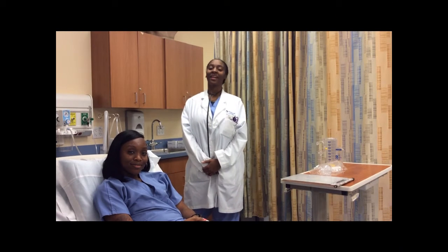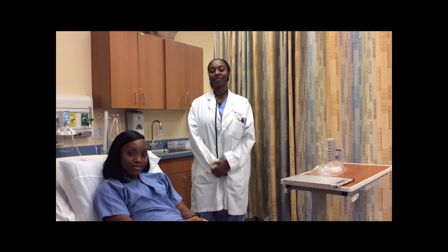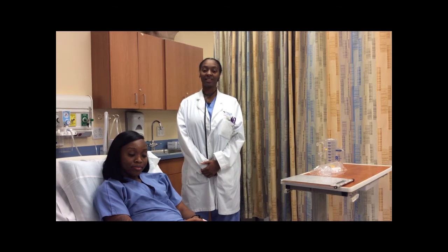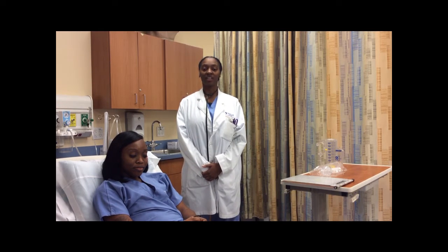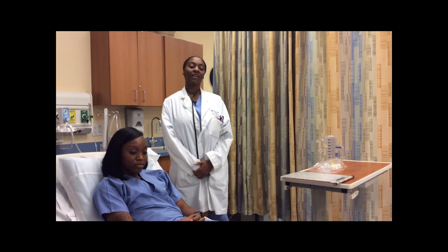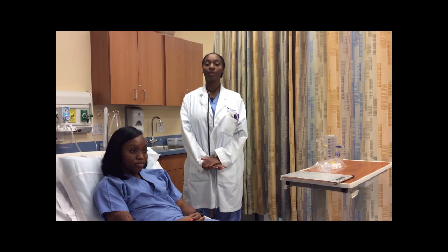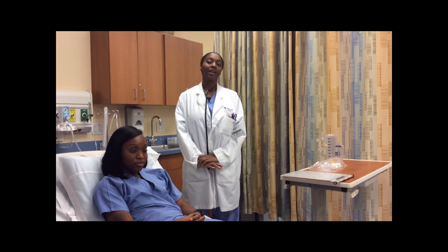Coleman. I'm a Miami-Dade respiratory therapy student, and I'm here to demonstrate incentive spirometry. But before I do, I'm going to tell you what incentive spirometry is, the indications, contraindications, and hazards. Incentive spirometry is a lung expansion technique used to help patients take slow, deep breaths.